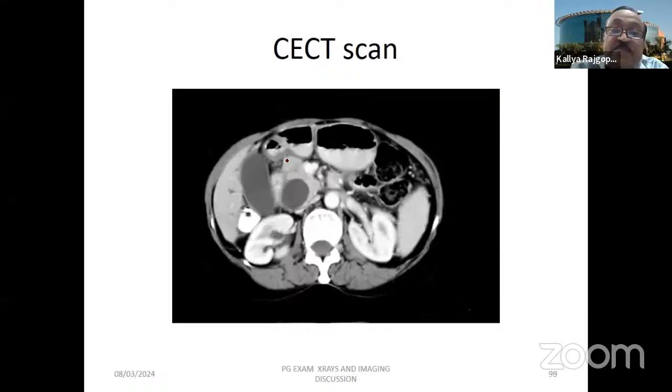Now look at this another picture. Yes, this is to show you only the distended gallbladder, very classical. And you can see here a very, very large common bile duct, which is dilated here. Again, a contrast CT scan, arterial phase; you can see a bright artery there. We can't really diagnose by looking at one picture.